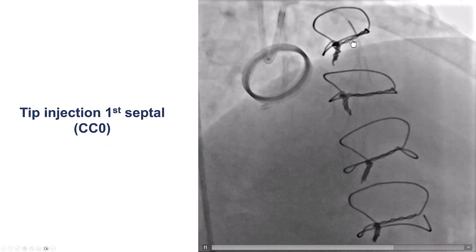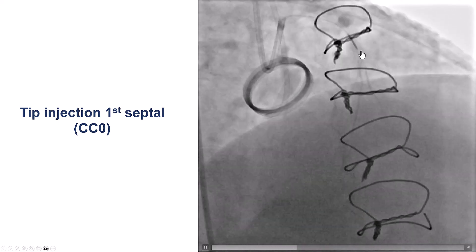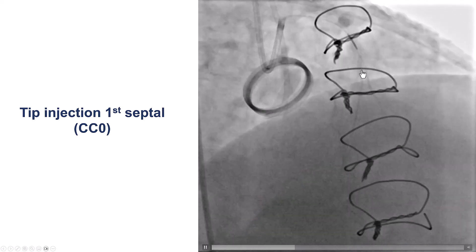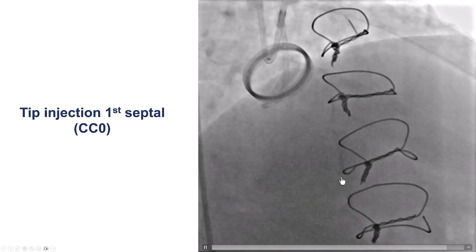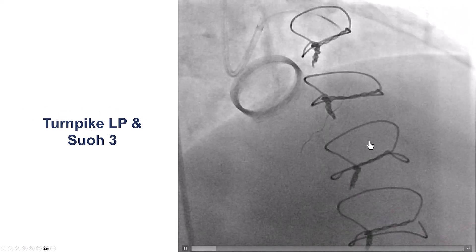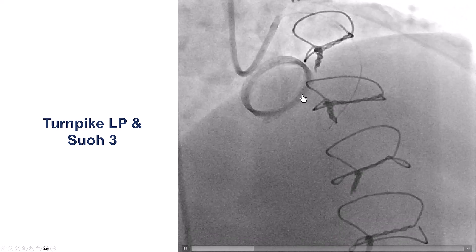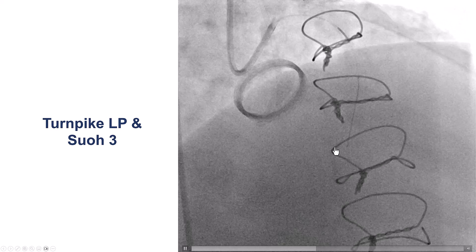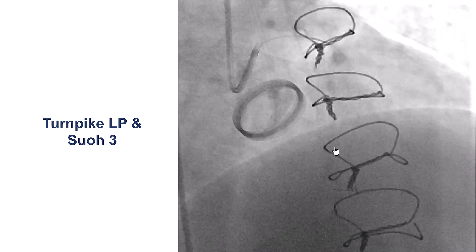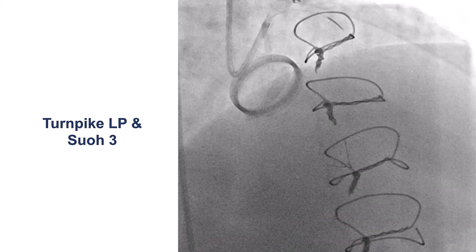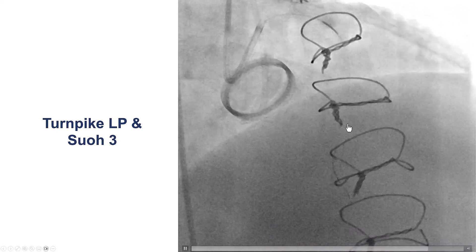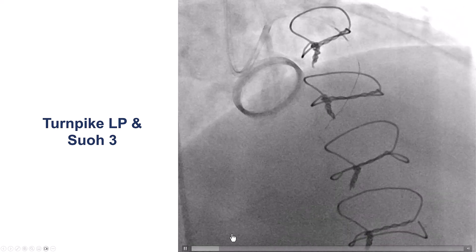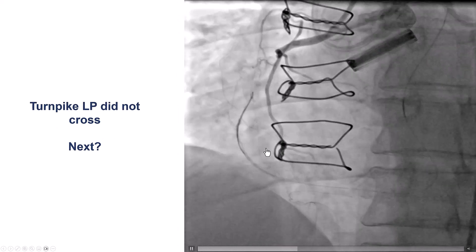We entered the first septal using a microcatheter. We did surfing — it didn't work. Then we did a tip injection; we don't really see a continuous connection between the septal and the right posterior descending artery. Nevertheless, we decided to surf it. This is a Turnpike LP along with the SUO3 guide wire. We're advancing the guide wire with simultaneous rotation, not using a torque — using this surfing technique. If it doesn't work, we pull it back and redirect. Eventually it does find a way and seems to be going in the right direction, as confirmed by contralateral injection.